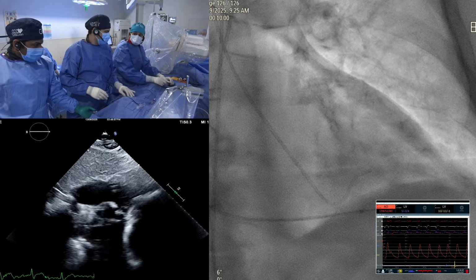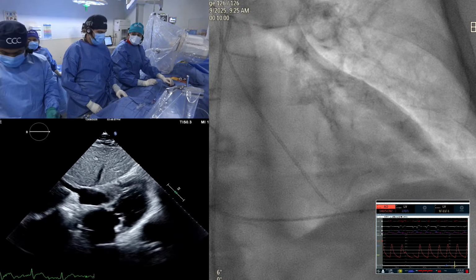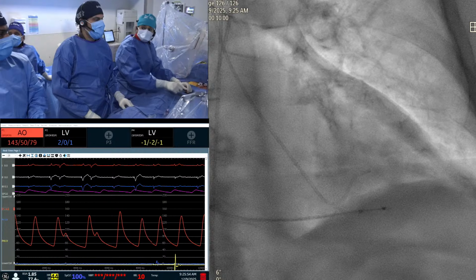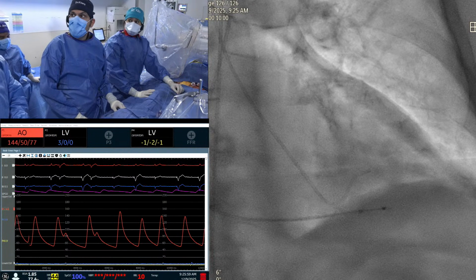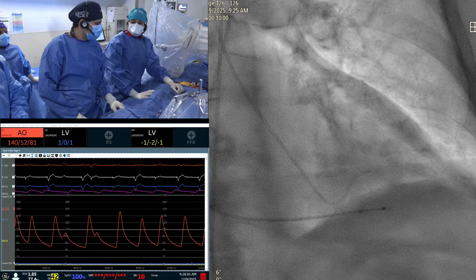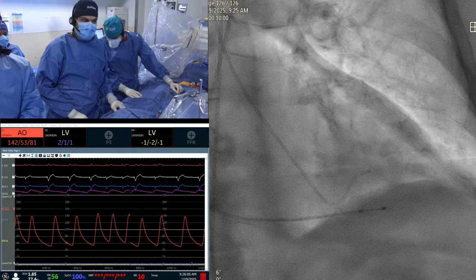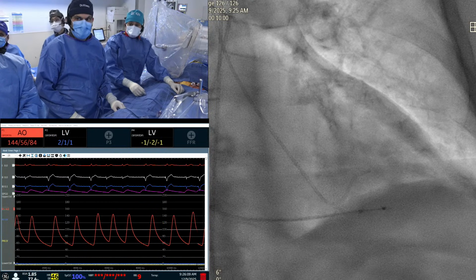So my advice to the audience out there, if this patient should have surgery, because of hostile anatomy or other reasons, but small annulus, ask the surgeon to make sure the STJ, when they close the aorta, is big enough for a future valve-in-valve option. It's very important now, irrespective of the patient's age, because we have seen patients who are 80 years old, even for surgery, come back 10 years later, and you obviously don't want to have surgery at that time.